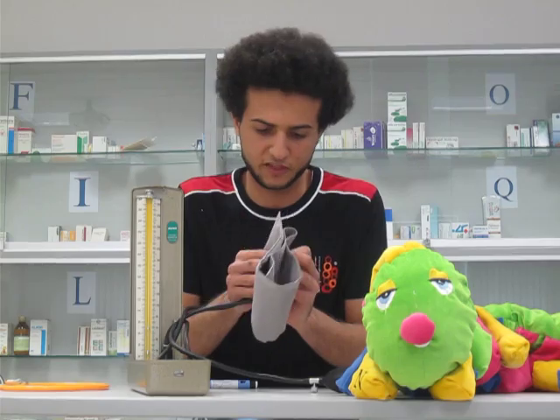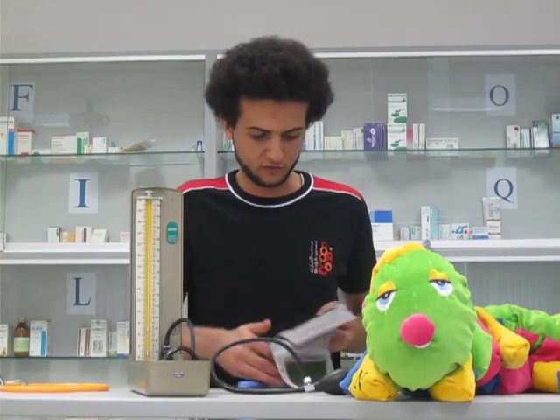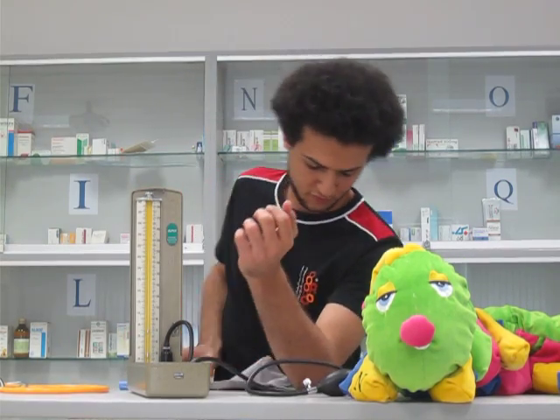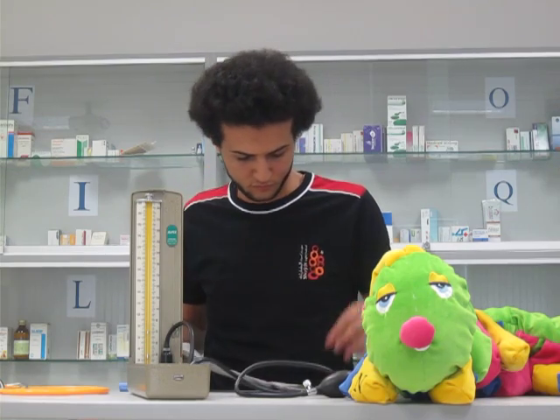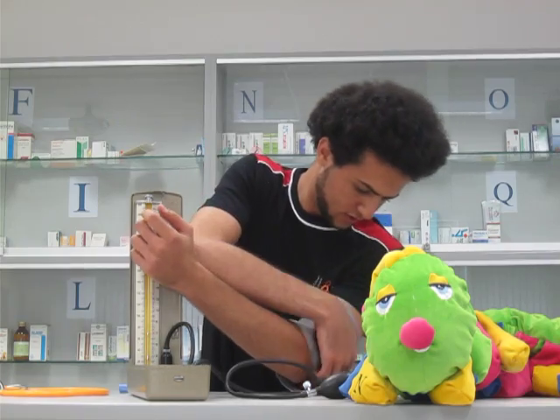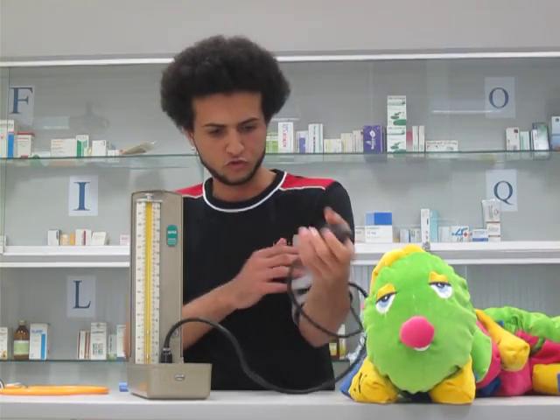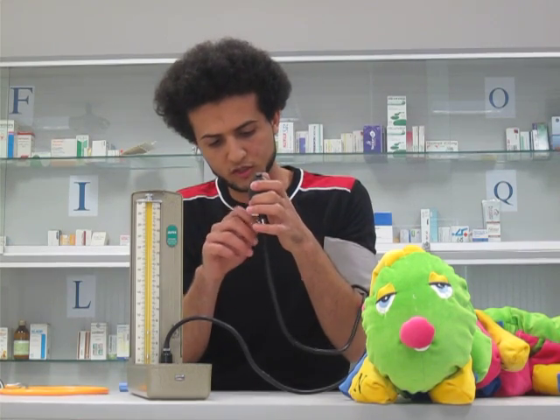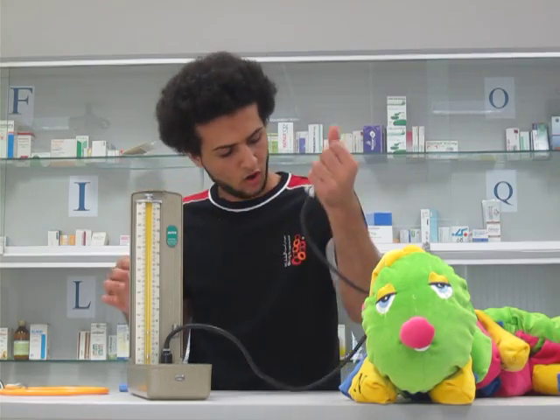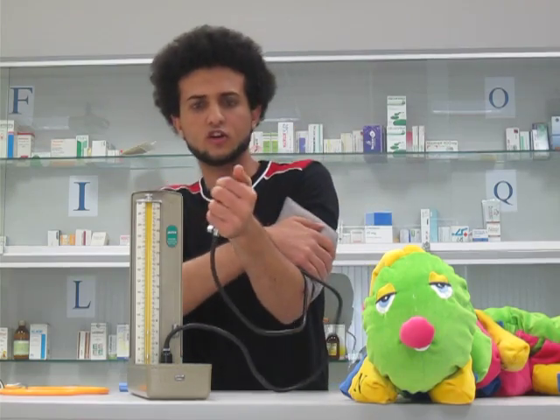It is very simple. What you do is you bring this cuff right here and you put it around your arm. This is a bit tricky to do, but because I'm doing it for myself, I think it's this way. Then it's this way — this one is closed. Then what you do is you make sure it is completely closed.